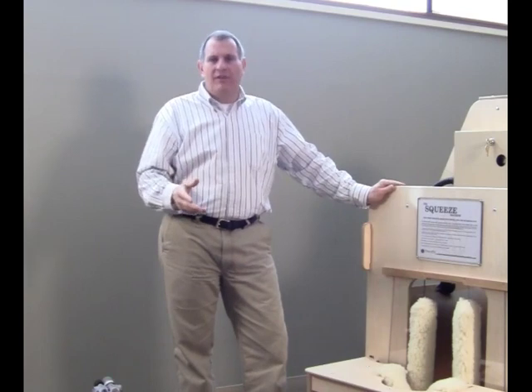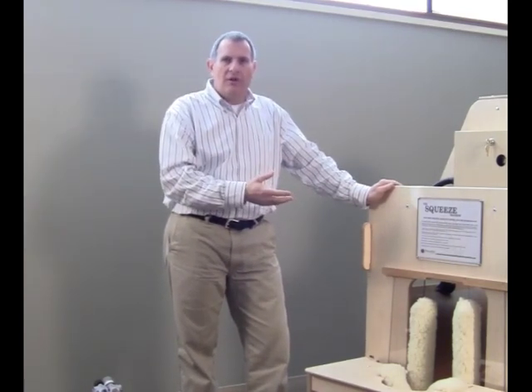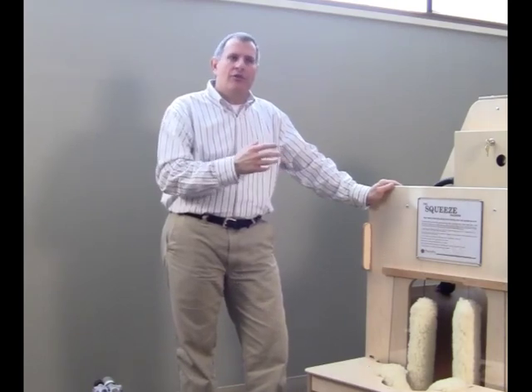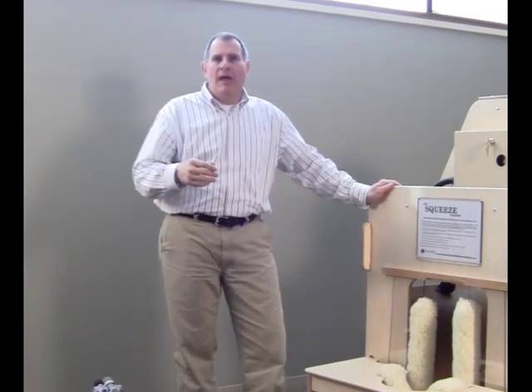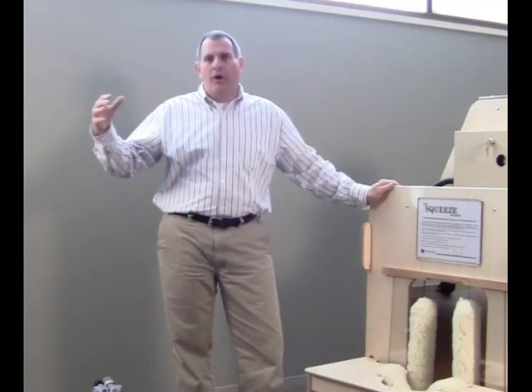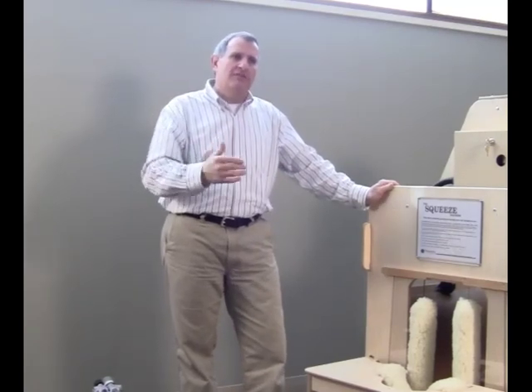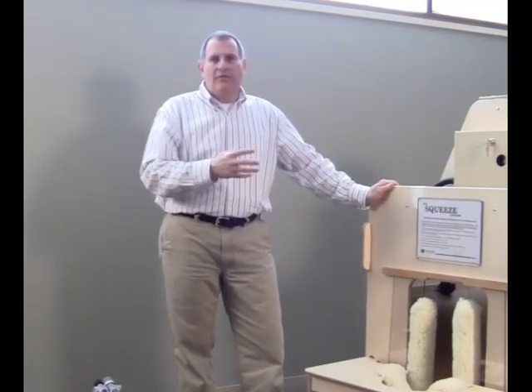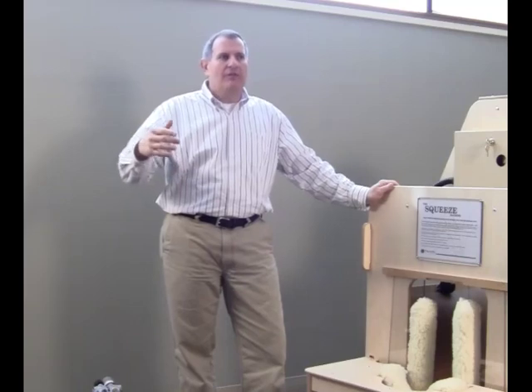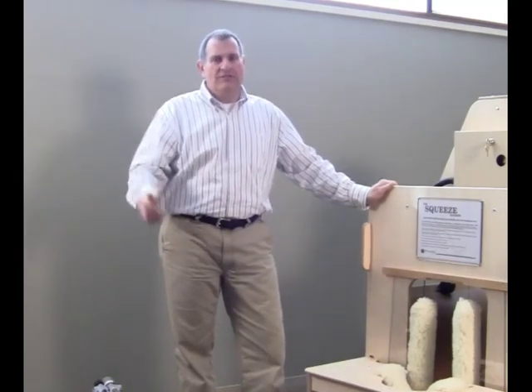We've also seen individuals who, as part of the regimen, use the squeeze machine, and that calming effect on their nervous system has helped them as they move on to auditory and visual training in other parts of their regimen. By introducing the squeeze machine into that process, we've seen them have greater benefits with some of the other training they've done with their other senses.